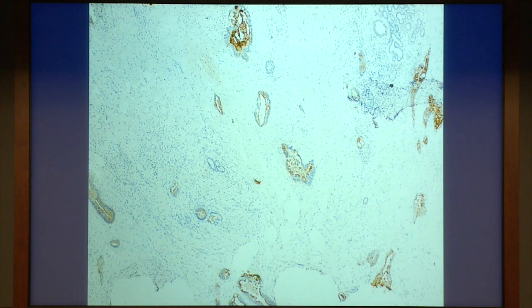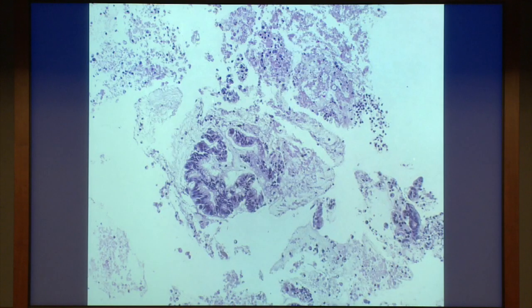To touch on the primary versus metastasis issue, I'm just going to share a stain from the mesothelin clinical trial in which we look at the stain to see if the patient is eligible. So they have to have staining. This brown, crisp, clear stuff is membranous staining, which is positive. And it turns out in the literature, and certainly in our hands, in primary tumors, the mesothelin stain is positive in about 70 to 80% of all comers in a resection. So this is great. Patient is eligible for the trial.